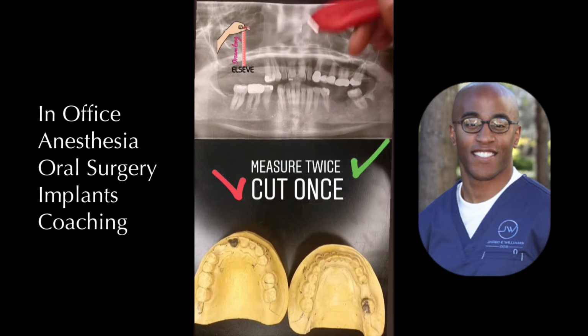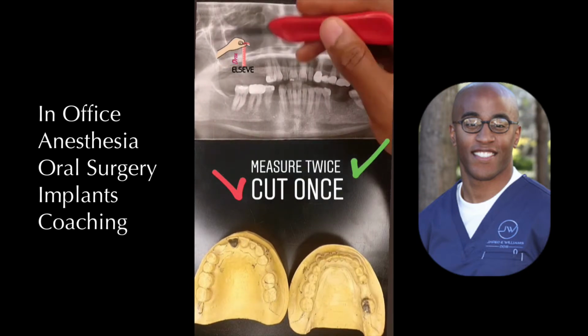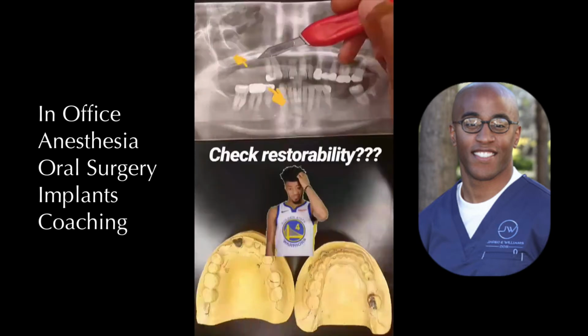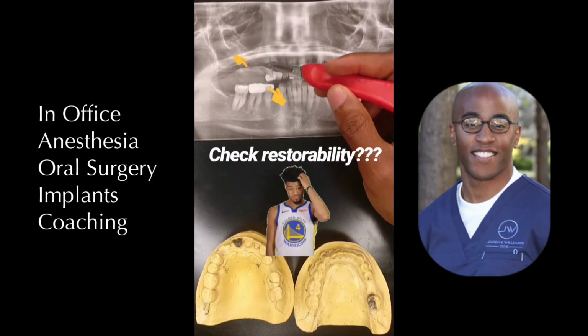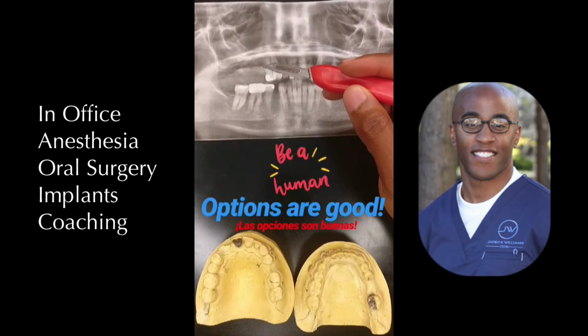Another thing that you want to take in consideration is this: determine the height where this implant is going to be placed. Just remember, you want to stay away from any vital structures, and you want to make sure that you are in a position to place it with the amount of width that's present. The next thing you want to take in consideration are opposing teeth. You want to make sure that these opposing teeth aren't too close to this alveolar ridge because it affects restorability. So you want to keep that in mind.